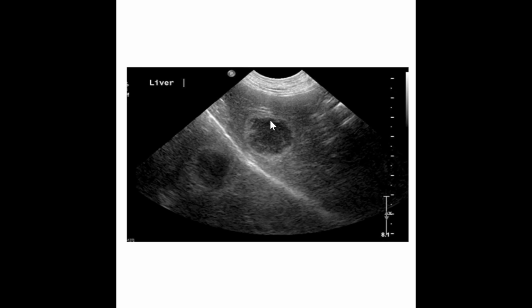More beams came through to create the rest of the image, and those accurately identified the structure being in this location. Again, notice that they are on opposite sides of the specular reflector. They are the same distance from the reflector. They are exact replicas of one another. And the big part is that the artifact is deep to the true anatomy.